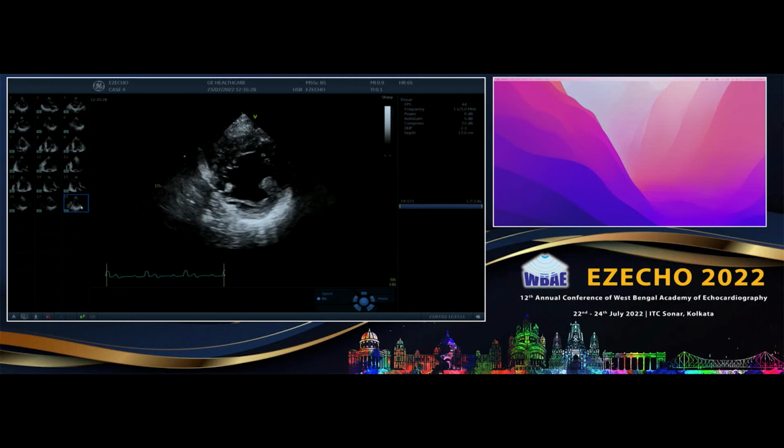So you should see the epicardium and the endocardium. Now epicardium always looks very white because, simple thing, pericardium has got a high reflectivity. So it looks white. Endocardium you have to pick up. So you have to adjust all your settings to get a good endocardium. And in 2 consecutive segments, if you don't see it, better to use a contrast.